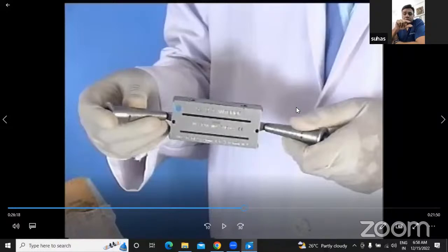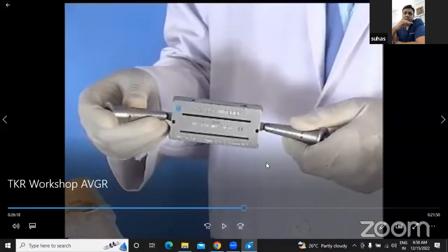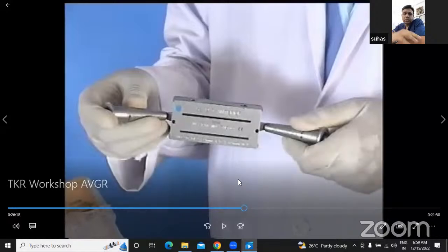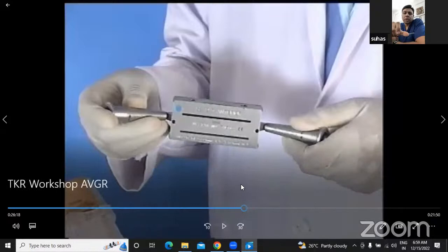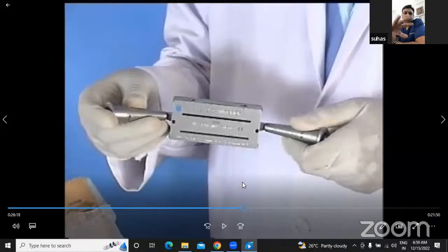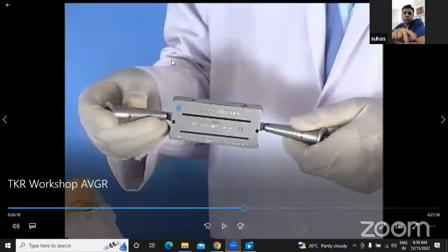Do you want to externally rotate or not? How much can you rotate beyond TEA? You can go at least till 3 to 4 degrees. So that should be your guide. By now you would have already cut your tibia. You know your extension space and flexion space to some extent. And if you feel your flexion is very tight posteromedially, and if you're somebody who likes to do a CR, where again it's a posteromedial stabilizer, you can tend to dial a little more external rotation in your femur. So these two points should guide how much rotation you want to give.